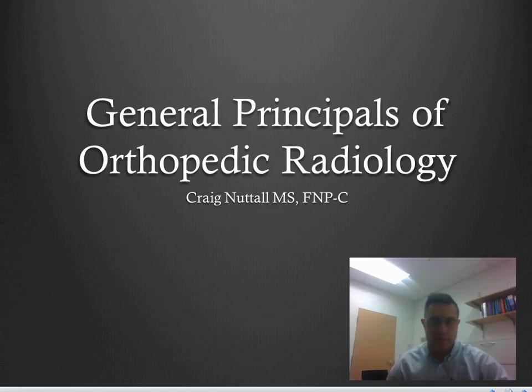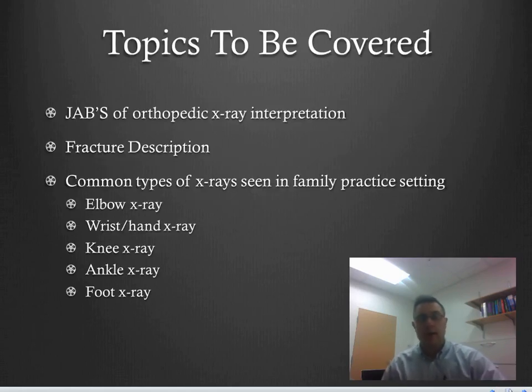Okay, so let's go over the topics that we're going to go over today in this lecture. We are going to go over JABS of orthopedic x-ray interpretation. JABS is my acronym that I've made up for how I approach looking at an orthopedic x-ray, so I don't forget something.